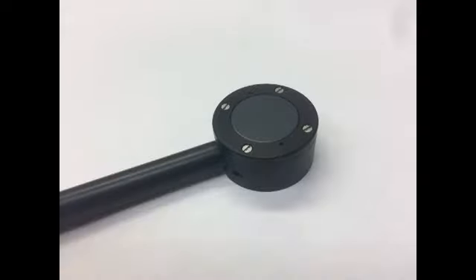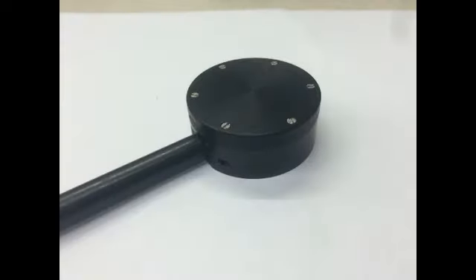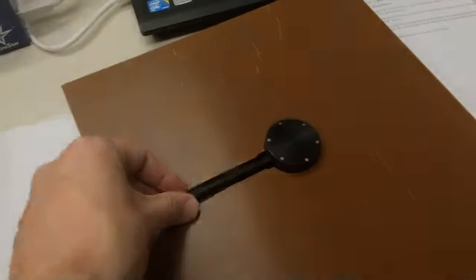Okay, so I showed you a Farmer chamber. Here's a different kind of chamber. It's a parallel plate chamber, or a pancake chamber. It's got a thin window in the front and the beam comes through that. Here's another similar chamber, just slightly different geometry. These chambers, again, will slide into some holder like this, and you measure in the beam.